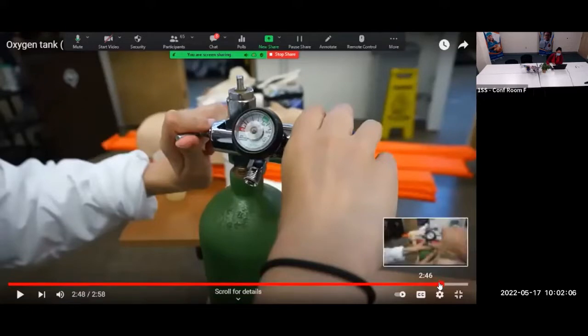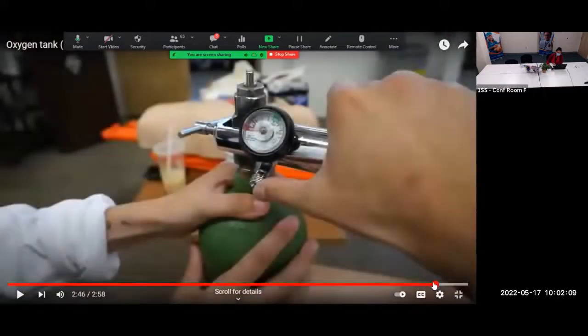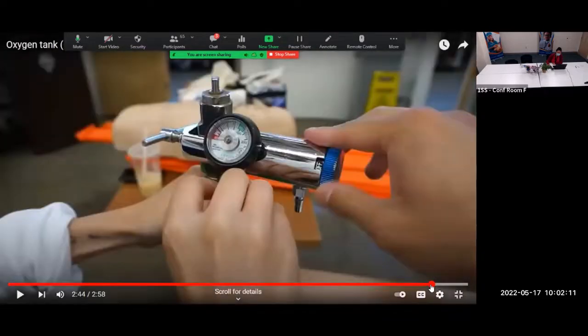What you might need to do instead, if you want to take the pressure out of the regulator and make sure there's no extra oxygen hanging around, is instead of pressing that little quick connect button, what we can do to drain the regulator of any extra oxygen hanging around the neck of the tank is go to your dial here where you select how much oxygen you want to deliver, and you could actually just bleed out the tank.